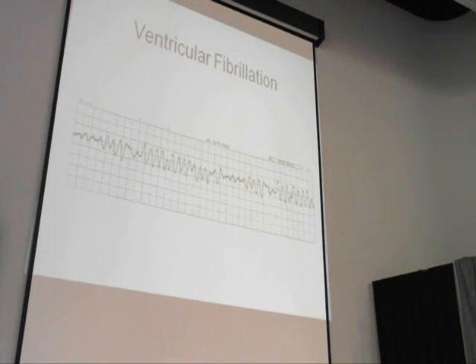The ventricles are like a big bowl of jello in here, just shaking, or a bowl of noodles, just shaking. That's fibrillation. So the patient in V-fib is pulseless, breathless, dead. From a breathing and functional standpoint they are coming to dead. The only chance of survival they have is early diagnosis of the condition, get the monitor on, see what rhythm we're in, and defibrillate.